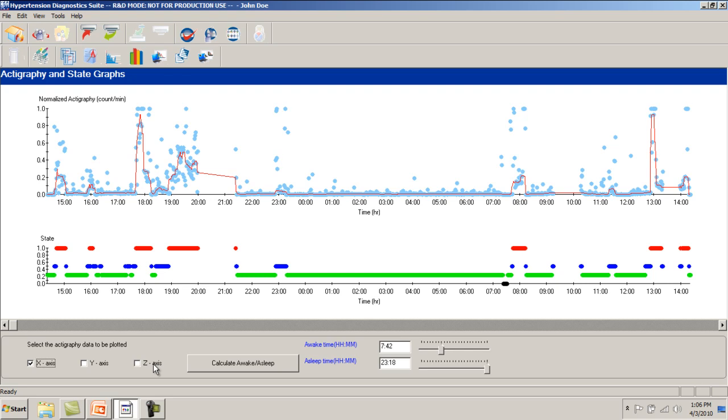The data is subsequently filtered and trended, as seen as the red line in the top graph, and used to determine the level of activity during each period.